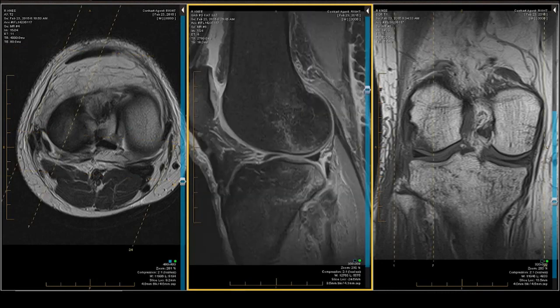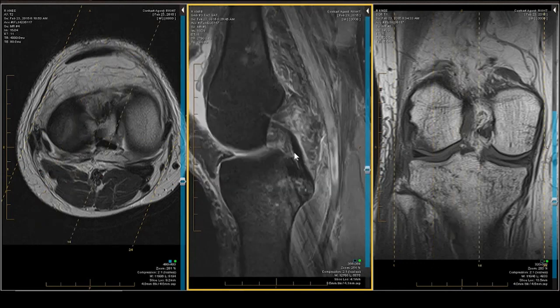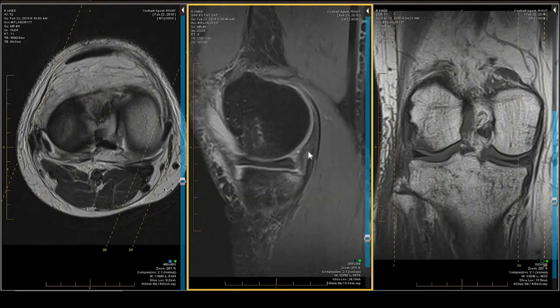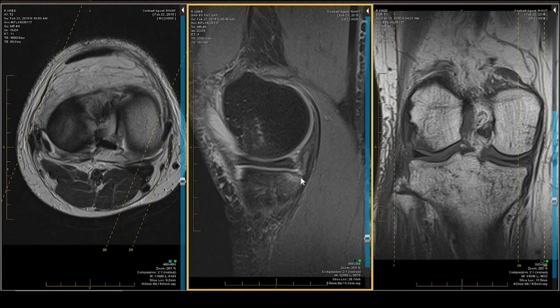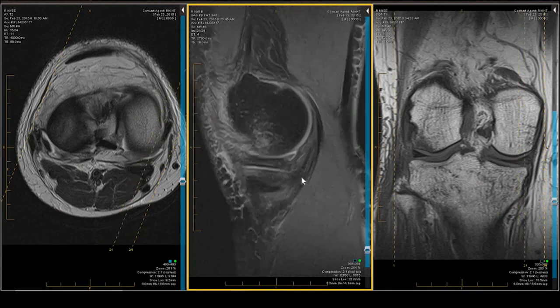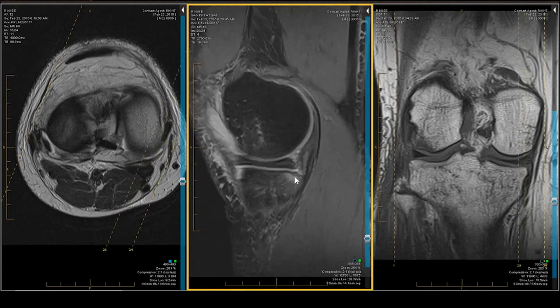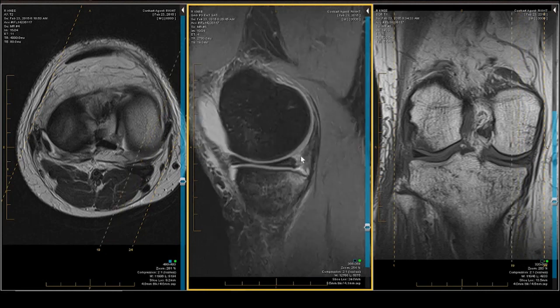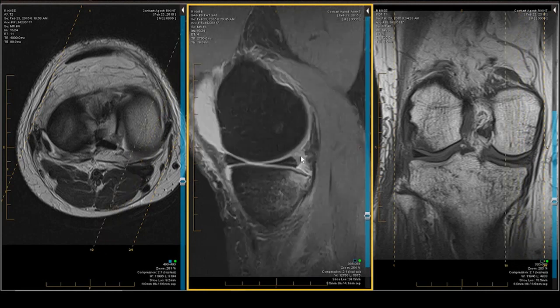Let's bring up the sagittal projection and go to the less-affected corner first — the posteromedial corner. You can see a small fracture with cortical disruption and a little depression. The semimembranosus is still inserting. There is a little swelling at the meniscocapsular junction, and a little more swelling as we move toward the lateral side.